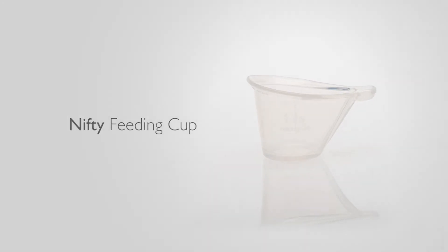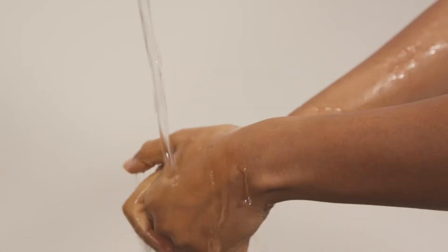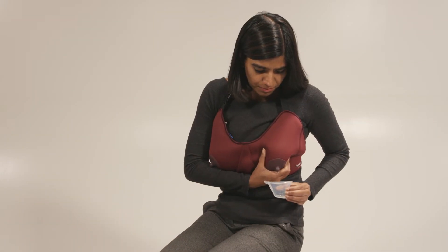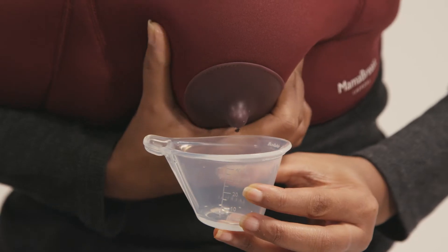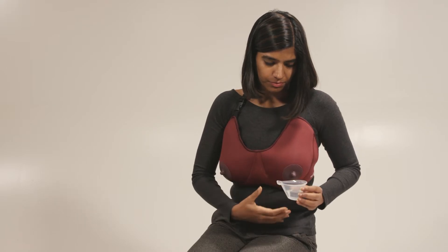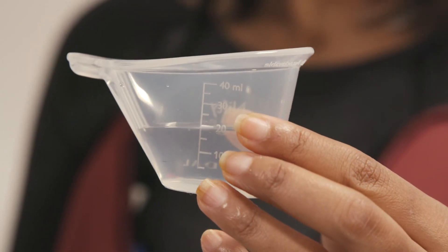Make sure the Nifty Cup is clean before each use. With clean hands, express breast milk directly into the cup. Use the volume markings to measure the amount of milk.